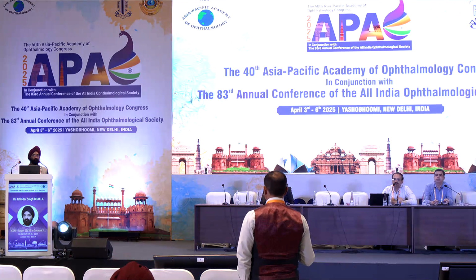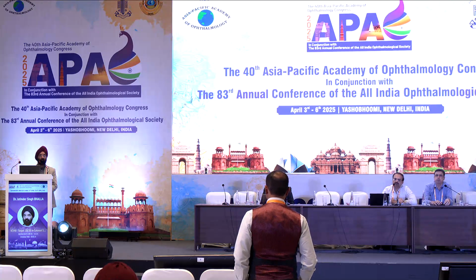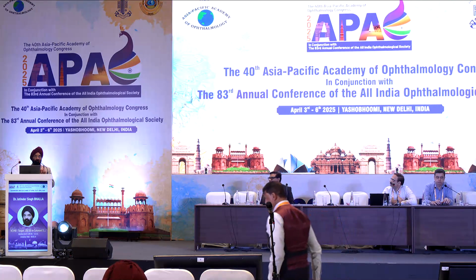Just add one thing, Dr. Bhalla. All readings should be taken in undilated pupils. Very true. It should be avoided in dilated pupils because you get more errors with that. I think keratometry should be done first, before you put any drops in the patient's eye, because things may change. So always see to it that once the patient enters and you do this cataract workup, it should be a virgin eye where you have not put any drops inside the eye.